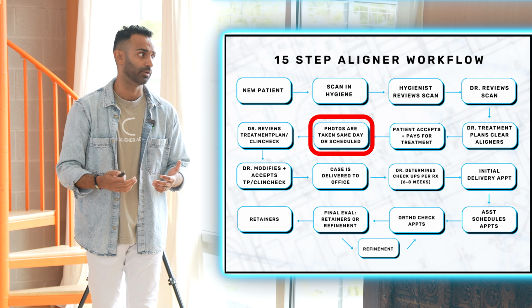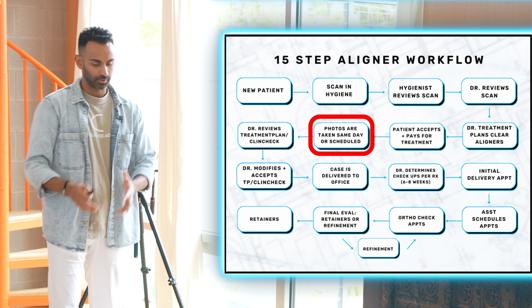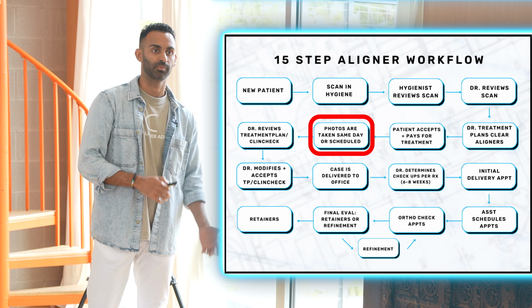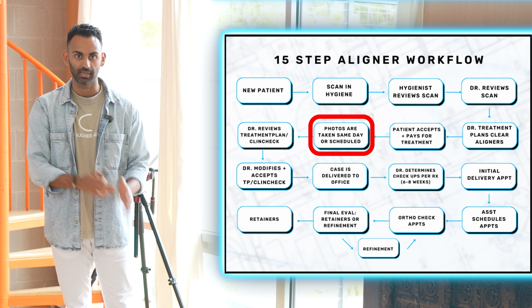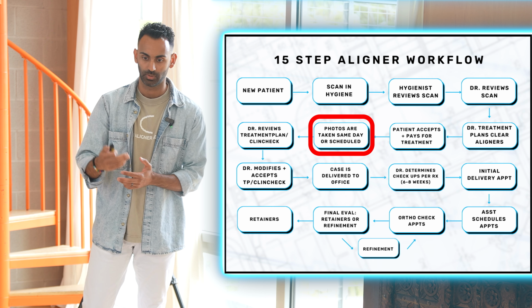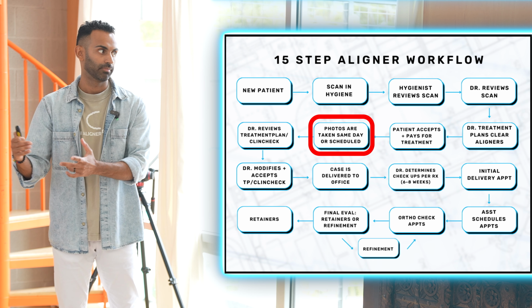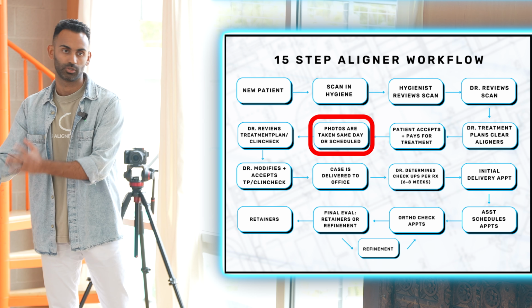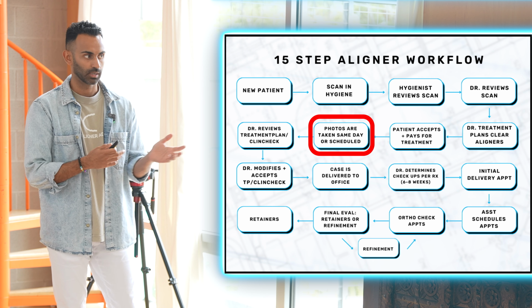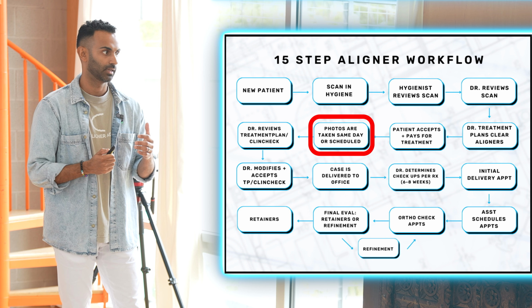And then that's when we would take photos. I know the question comes up: do we take photos and scans on every patient, or when does that step happen? So photos are only taken if the patient is going to move forward with the treatment. The scan has to be done before, but the photos are always after the fact. So after the financial situation is sorted, one of the team members, usually the assistant, will grab the patient, pop them into a free chair, snap the photos following some of the protocols that we have, which I'll go over, and then they're free to go.